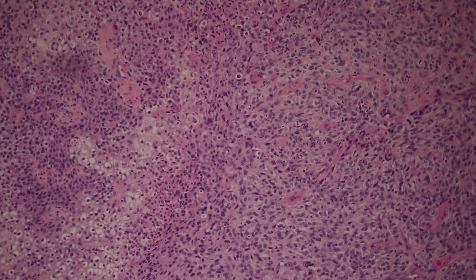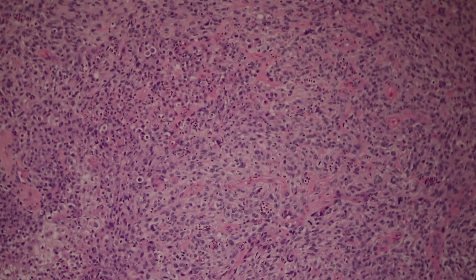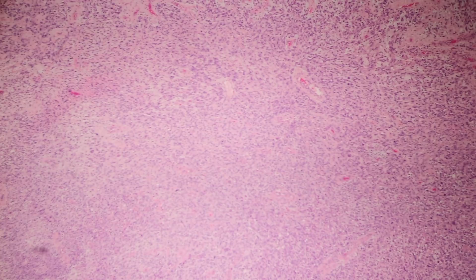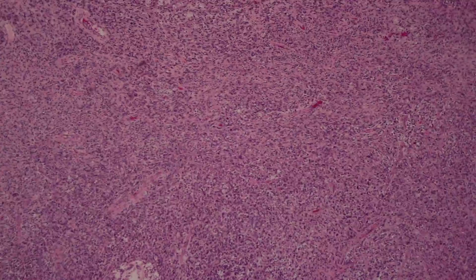And we've used them elsewhere in the body and pathology, but sometimes I feel like if I say it's a squame that's moderately to poorly differentiated, or that it's poorly differentiated and it has spindle cell component, that's more easily understood. We're dealing with a really nasty high-grade squame, and that's how it's going to behave. Certainly something like this could be aggressive and could metastasize, but I wouldn't want someone thinking they need to treat this like a sarcoma. It needs to be treated like a really bad squame.